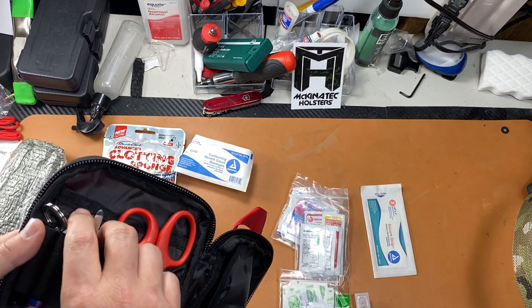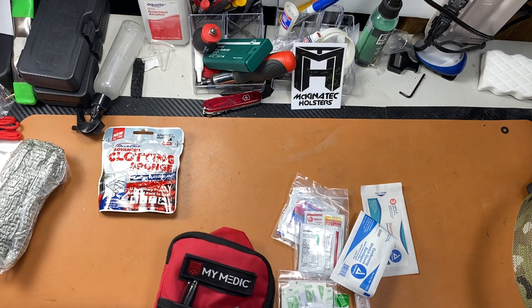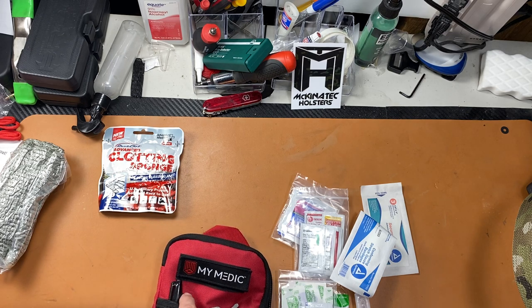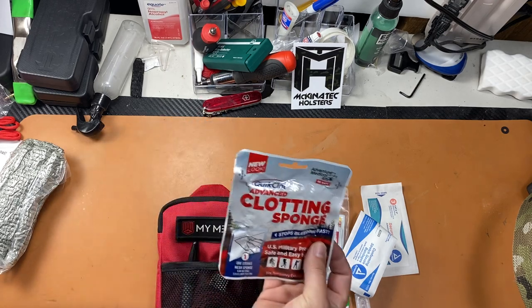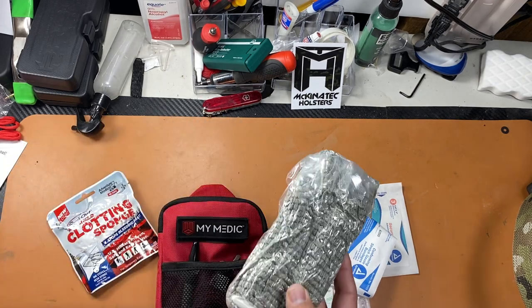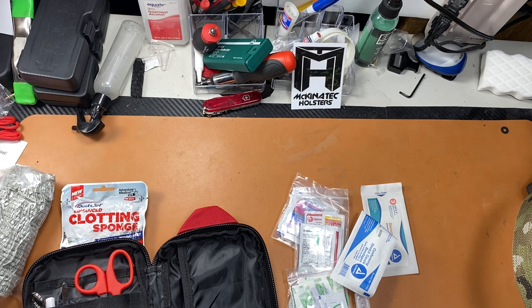To what comes in the kit, I personally added a Sharpie marker, a RATs tourniquet, a QuikClot sponge, and an Israeli bandage. I carry this on my range belt in case I need to perform first aid. Things I might add in the future are a chest seal and a nasal airway.